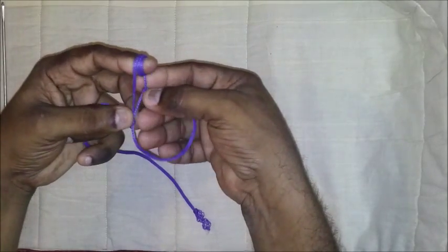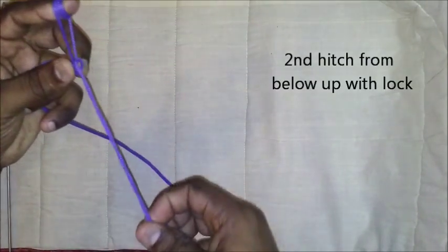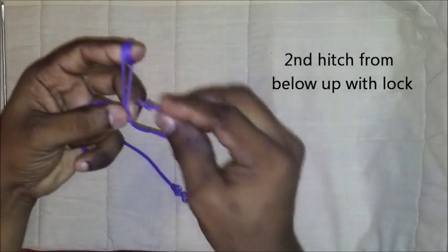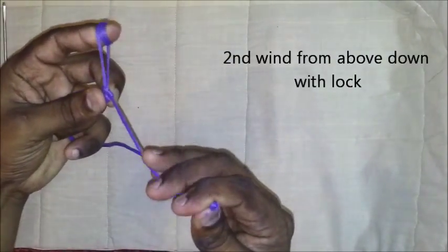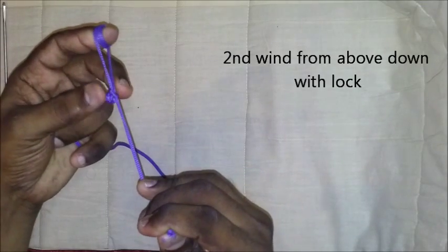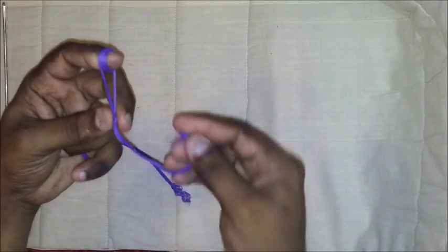A second hitch with lock is taken on this limb. A second wind over both from above down with lock.